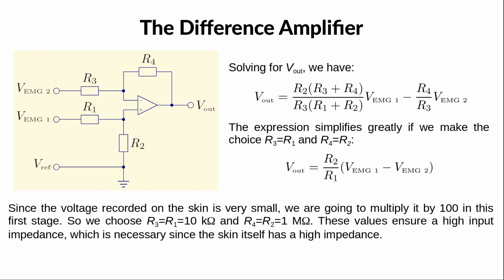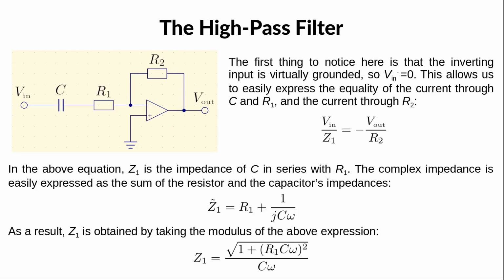But Vout simplifies greatly if we choose the resistors such that R3 equals R1 and R4 equals R2. Then Vout is a constant multiple of the potential difference between the two inputs. That's why we call this circuit a difference amplifier. Now, because the voltage recorded on the skin is very small, we need to amplify it. So here we are going to multiply it by 100. All we have to do is to choose R3 equals R1 equals 10 kilo ohms and R4 equals R2 equals 1 mega ohms. The signal is still very weak, but we cannot amplify it further yet.